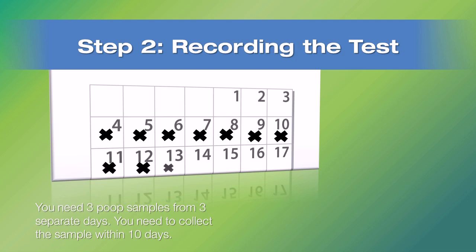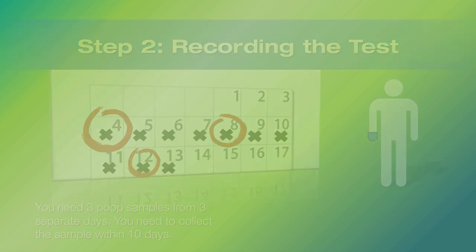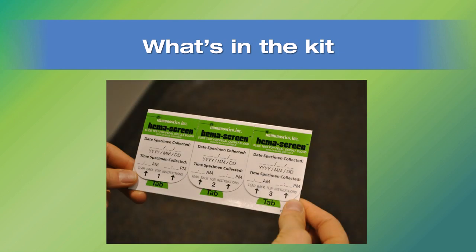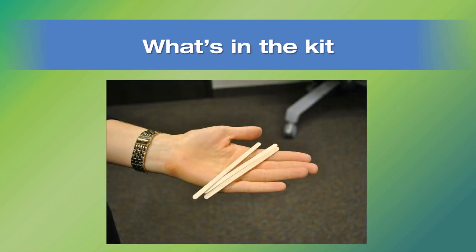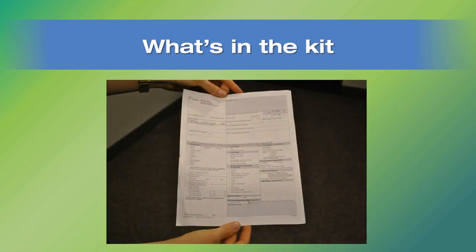If it takes over 10 days to do this, the kit won't be analyzed, so try to complete it all within 10 days. Some people find it helpful to use a calendar. You can mark the first day you took the sample to make sure you get all the samples taken before 10 days are up. So let's get going. Here's exactly how to do the kit. Unpack the kit and you will find the test, 3 sticks, 2 envelopes, the instructions, and a lab requisition.